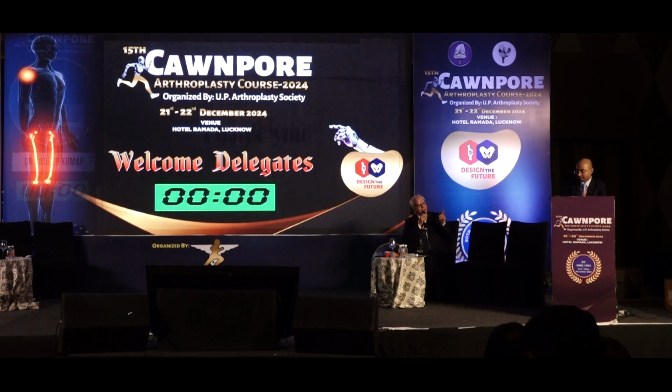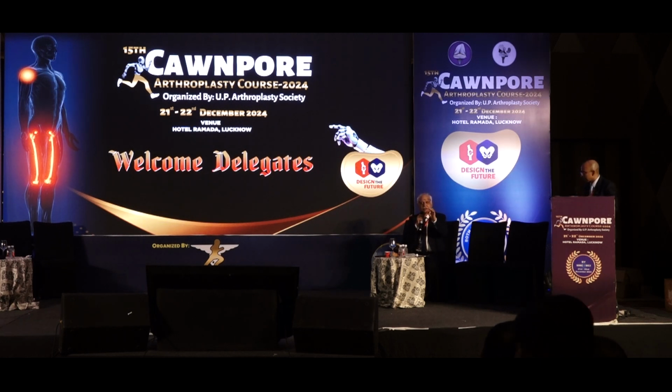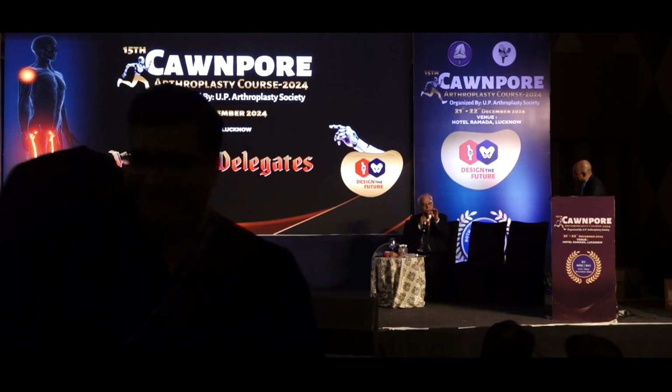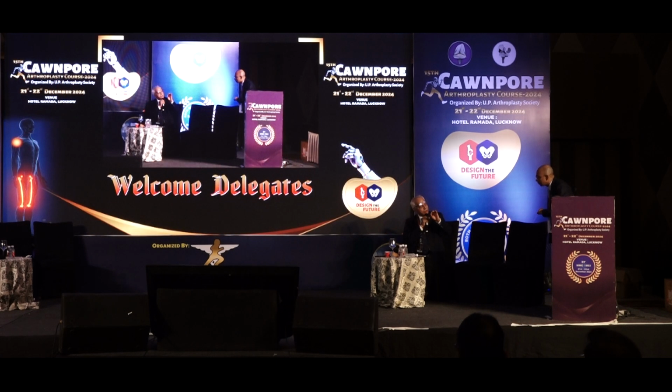Okay, so I just want to ask one question, which is a very common situation. You are handling a tibial defect, you have taken the cut. Now, what is the threshold where you can leave that defect filled with only bone and screws, vis-a-vis where you must add a rod also, because a rod means 25,000. So we're always a little bit worried about the money part.